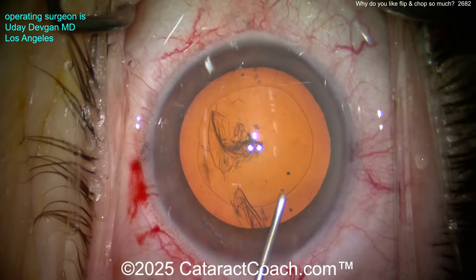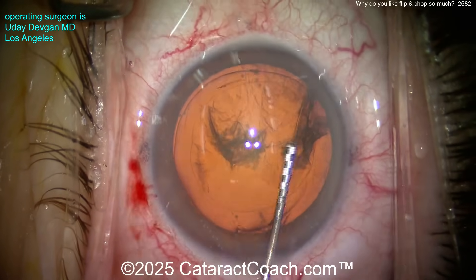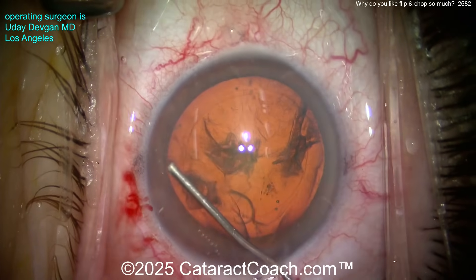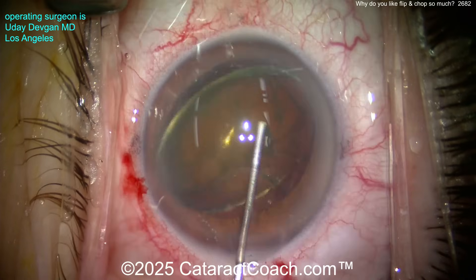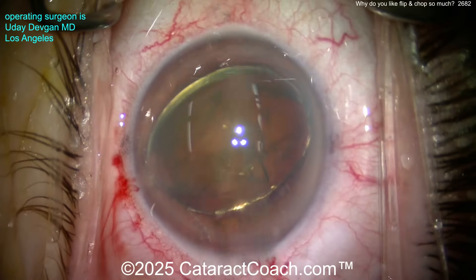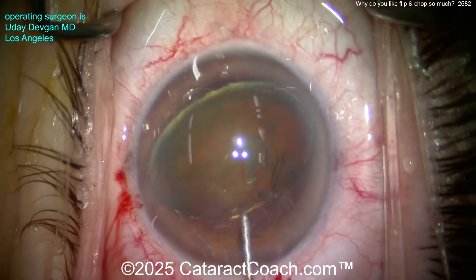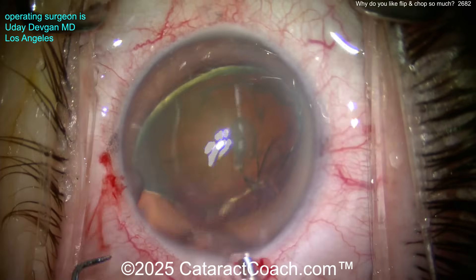Here's the hydrodissection — here's the trick. Watch the fluid wave. If it doesn't go, try the other side. Notice we're going with the cannula to the side, not across the nucleus. There, the nucleus comes up — it's only partially prolapsed out of the bag, just a little bit. Now put an extra aliquot of dispersive viscoelastic right there, just to protect that corneal endothelium in case we lost any with the hydrodissection.